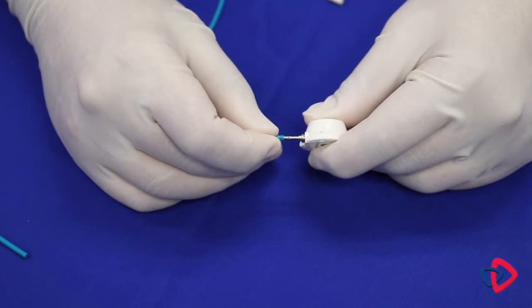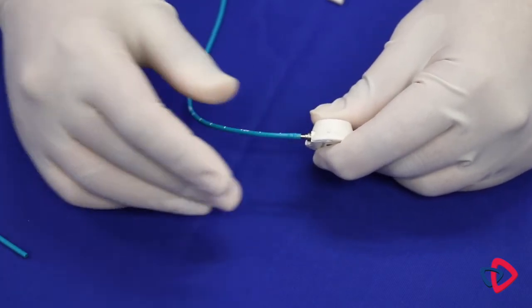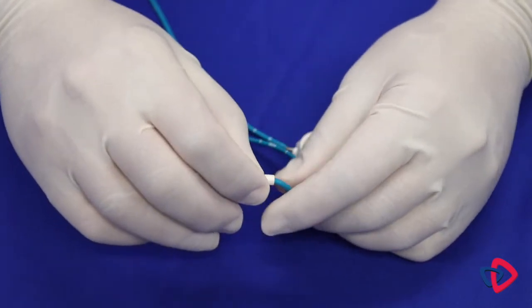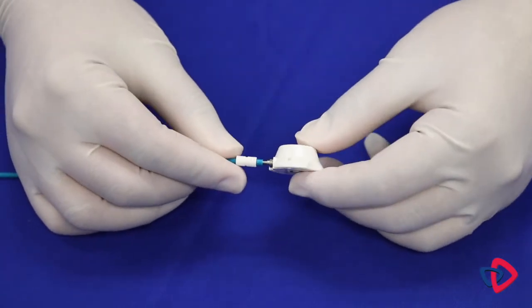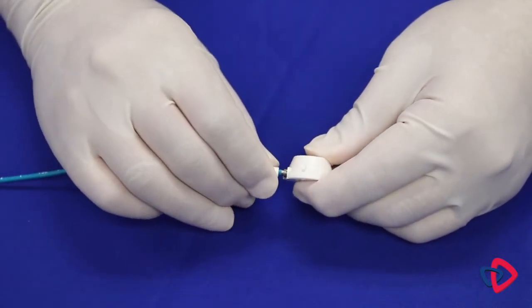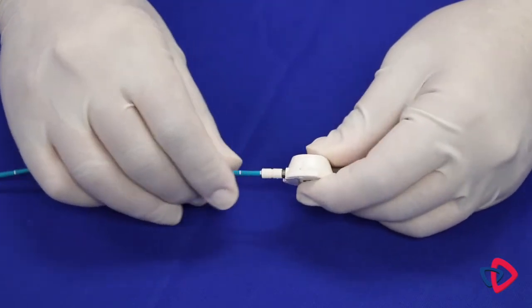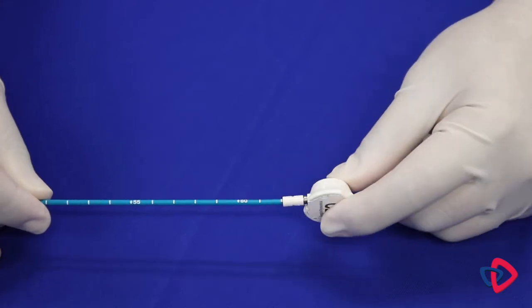Advance the catheter over the port stem to the midway point, slightly past the first barb. Slide the snap lock connector toward the proximal end of the catheter. The locking mechanism is bi-directional and can be oriented in either direction on the catheter. Advance the snap lock connector, pushing from the back of the lock, until it engages with tactile and/or audible feedback.